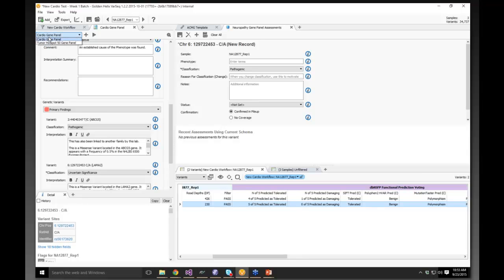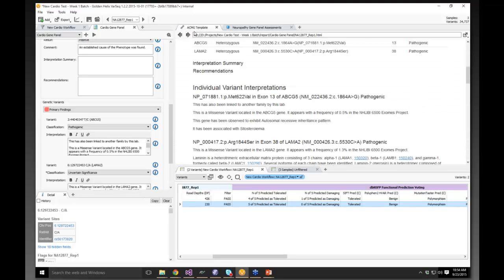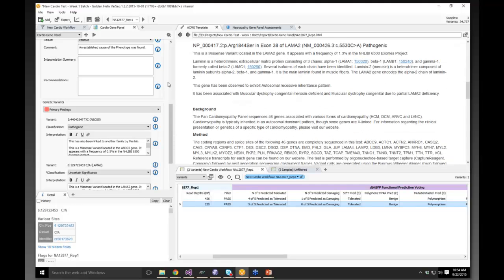And again, you could have one of these designed for each of the reports that you need to produce. Obviously for a different panel, you're going to have a different set of disclaimers. You might have everything else be the same, and all you tweak is the disclaimer on the bottom. That's easy to do and clone, and it's basically a folder with a bunch of configuration files that you just copy and paste. So it's a very customizable, per-lab process.